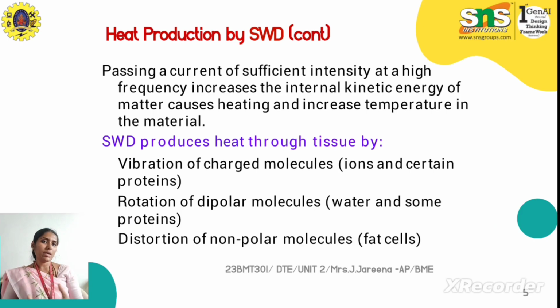The high frequency waveforms increase the internal kinetic energy of these ions or cells, ending up with oscillation, vibration or rotation, which produces heating and a rising temperature in the particular area. As a result, heating enhances the blood circulation over the area, which further induces a treatment effect.